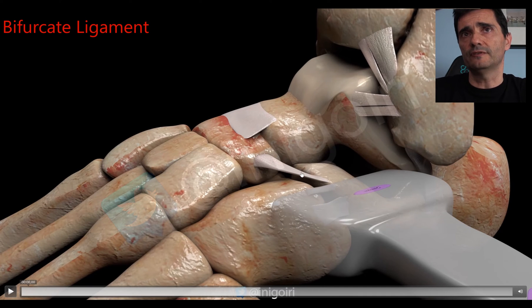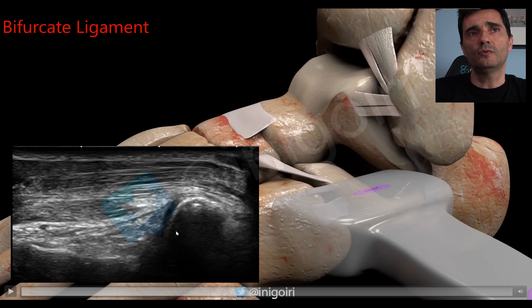The second ligament is the bifurcate ligament, which has two components: the calcaneocuboid ligament and the calcaneonavicular component. It is very important to check its insertions in the calcaneus bone because pathology usually occurs there. In the ultrasound image: the calcaneus is here, this is the superior and exterior edge of the calcaneus, this is the cuboid bone on its dorsal aspect, and you can see a very thin ligament below the extensor digitorum brevis muscle. A normal one is surrounded by hyperechoic fatty tissue.